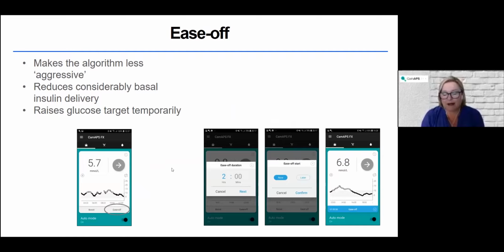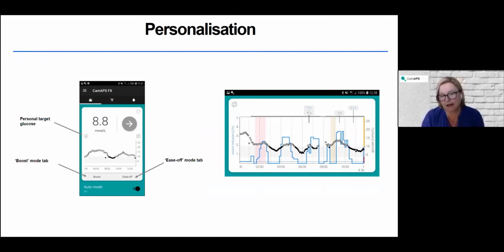The nice thing as well, sorry, Roman, just go back one slide. The nice thing as well is that you are able to see what's happening on your pump. So if you take the app and turn it sideways, you are able to see this detailed graph that you see on the right-hand side of your screen, and able to pinch the axes and scroll backwards to see what's happening now versus what was happening maybe a few hours ago, overnight. So you have quite a bit of functionality on the app itself, as well as all that information being uploaded to DiaSend that you can look through in detail when you have time. But having that sort of real-time feedback is very useful.